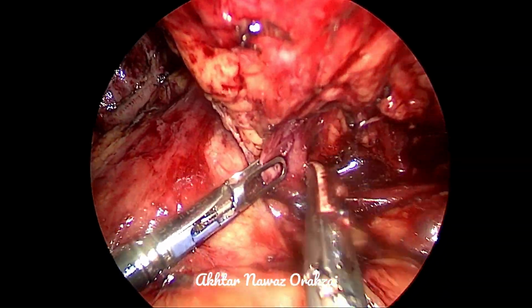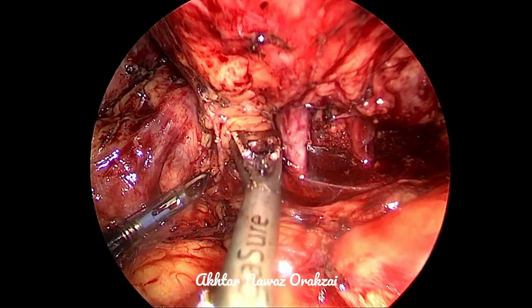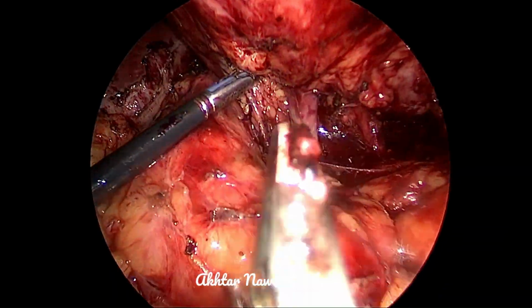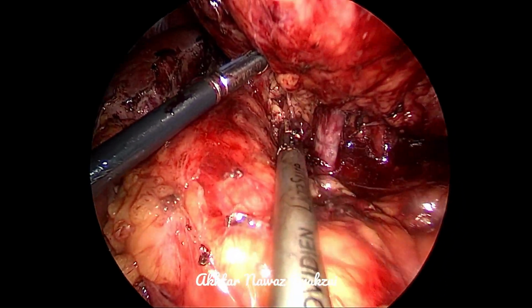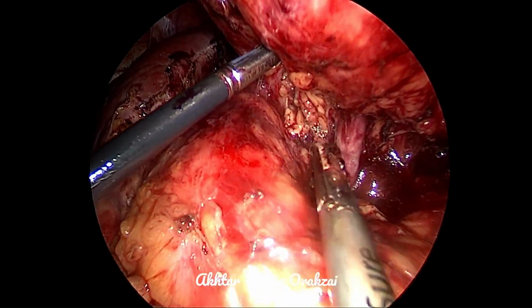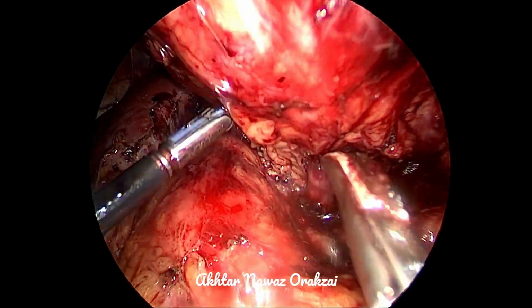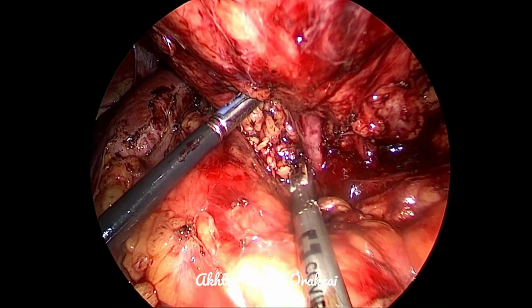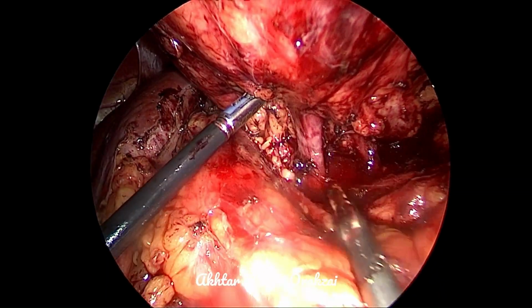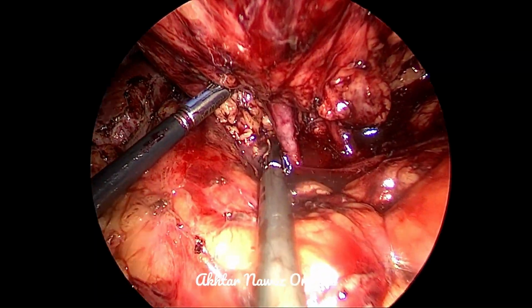So the tissue around the vein is being mobilized and dissected and divided. And after doing this dissection, we'll be using our favorite instrument, the 10 millimeter right angle, to dissect behind the renal vein.